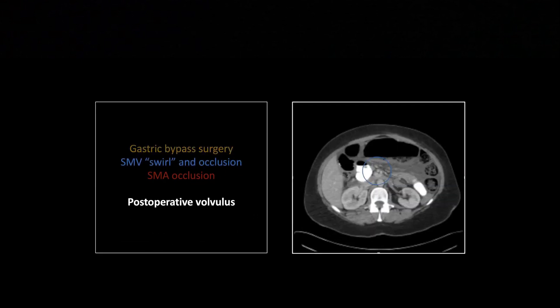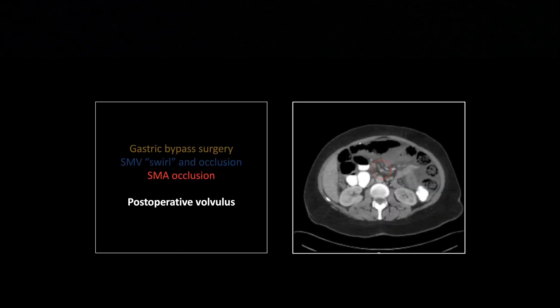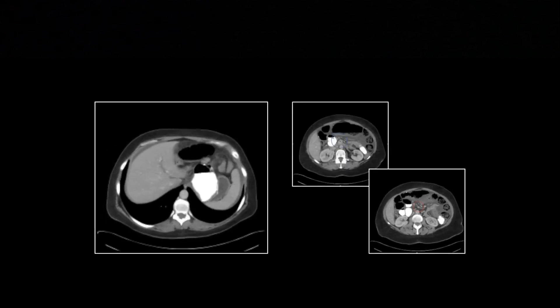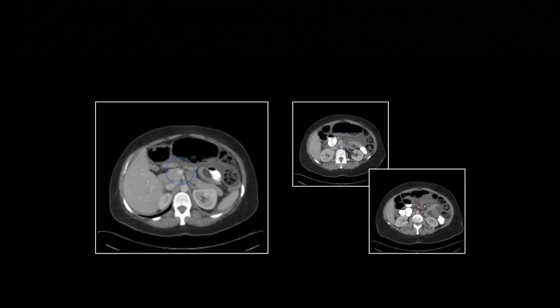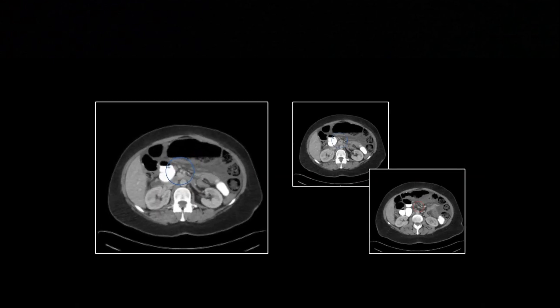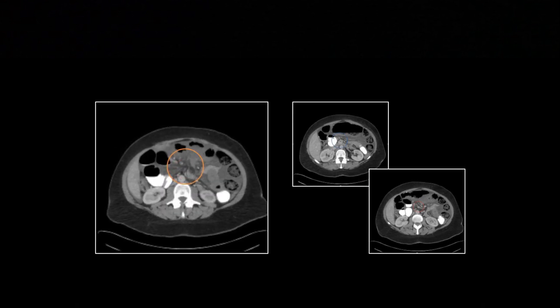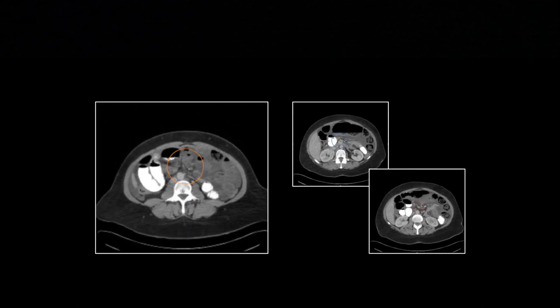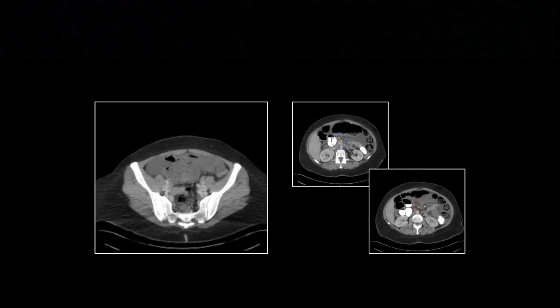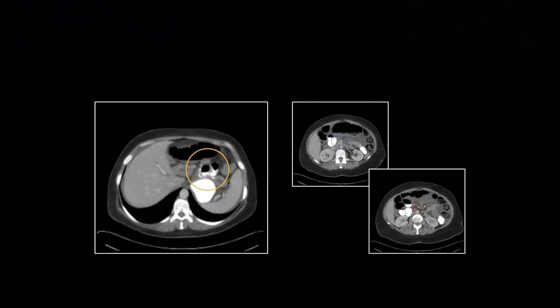Another gastric bypass case where the SMV and SMA both snuff out — visible because we have IV contrast. The SMV is lost, and just distal to that, the SMA is lost. Note also the cicatricial appearance of the small bowel — it's all being pulled together into one place, suggestive of a closed-loop obstruction.